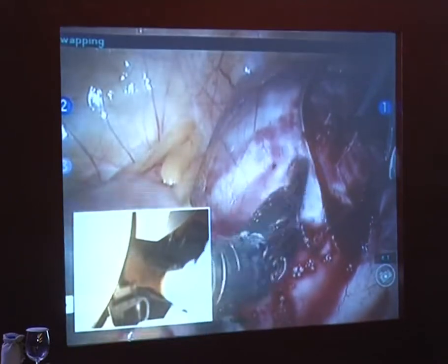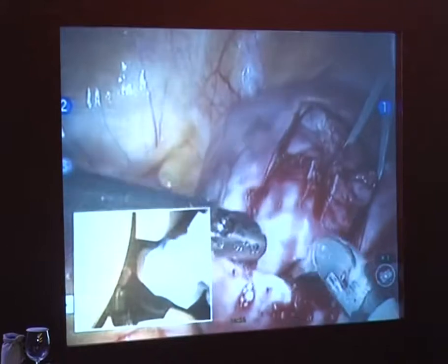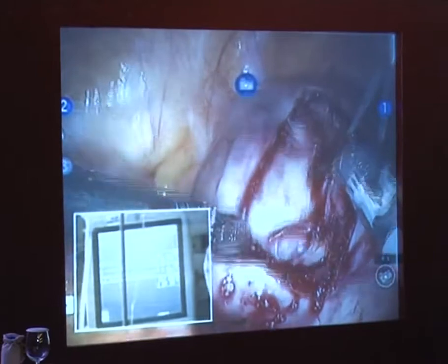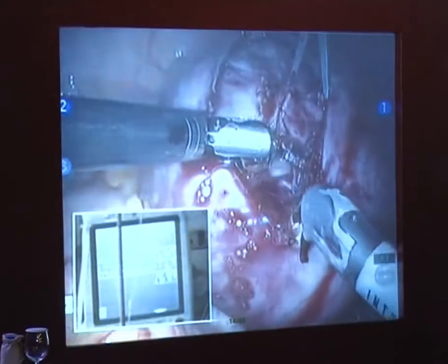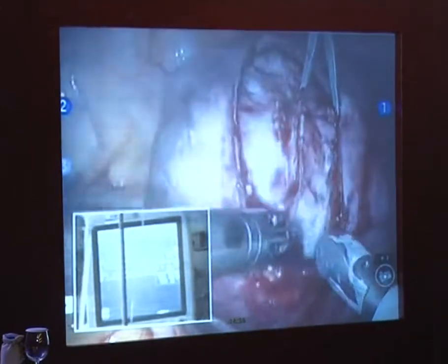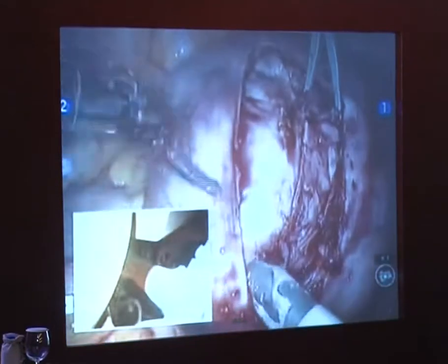So I'm going to slowly try to work on the best way to hold this. A lot of it is just fixation and then gradual delineation of where your dissection plane is. How he's bringing that arm in like this, that's how he keeps it out of the way. And I'm going to try to get away with as small a defect as possible here. So I usually cheat a little bit and I wait and see if this is going to come out through a much smaller incision like this one here.